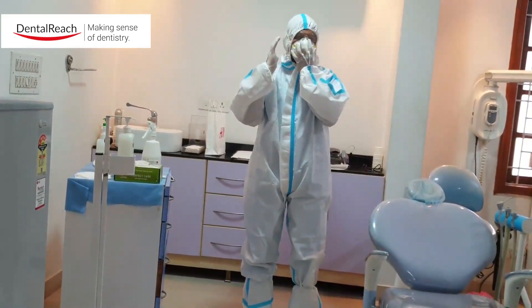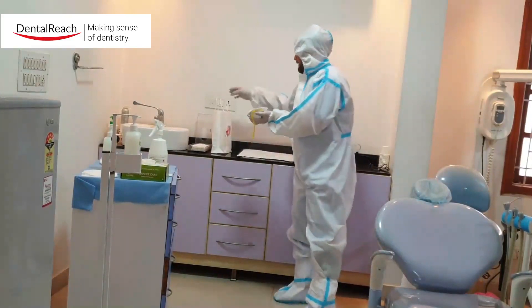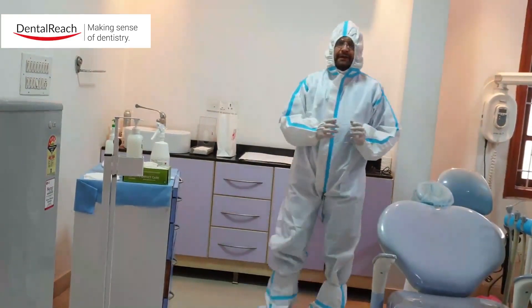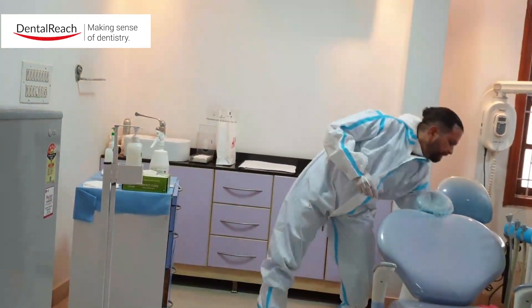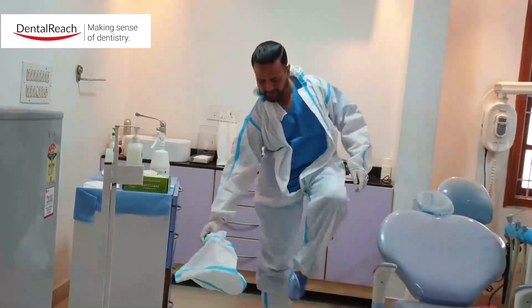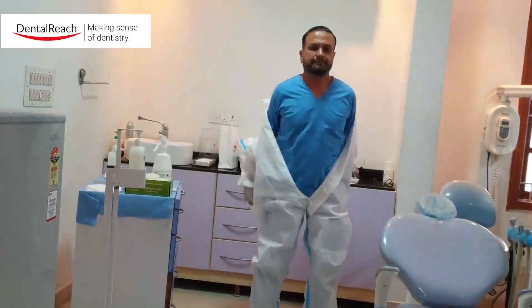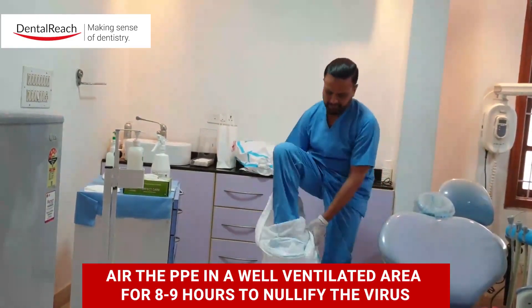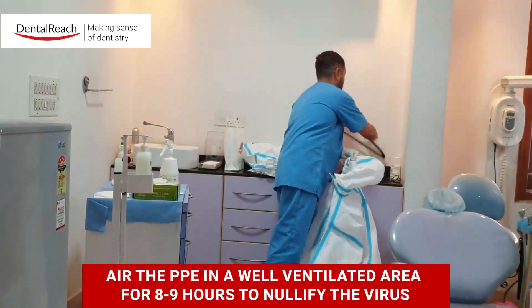The first thing I remove is my mask, making sure that I do not touch any surface. The N95 then goes into a paper bag. The next thing we doff is the head cover. The glasses go into the disinfectant. Then I remove the shoe cover.